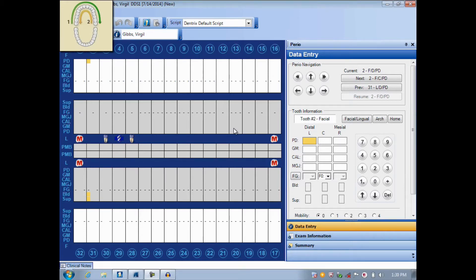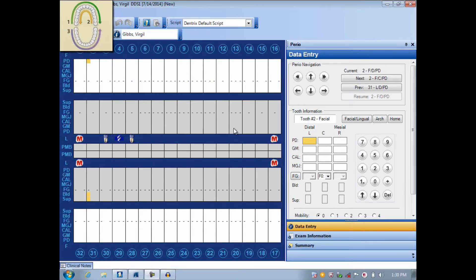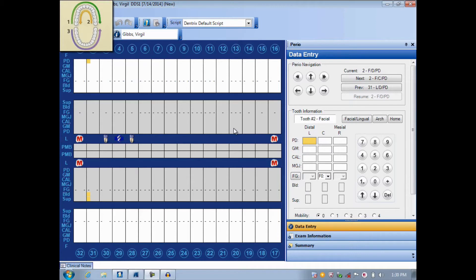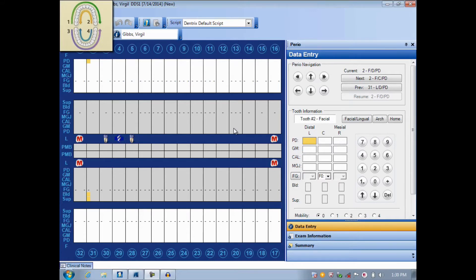Part 2 will then probe the lingual side of the mouth from tooth 16 to 1 in a right to left pattern. Part 3 will probe the facial side of the mouth from tooth 32 to 17 in a left to right pattern. And finally, Part 4 will probe the lingual side of the mouth from tooth 17 back to 32, moving from right to left.